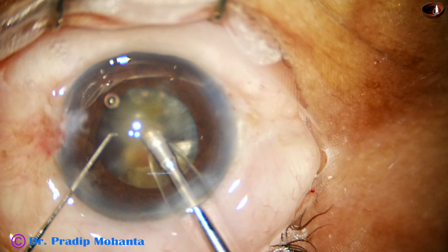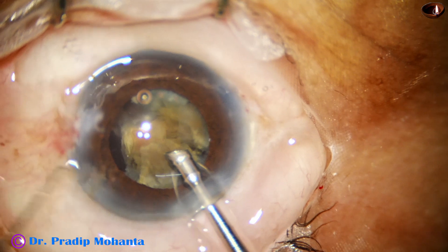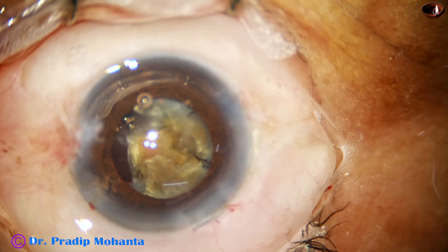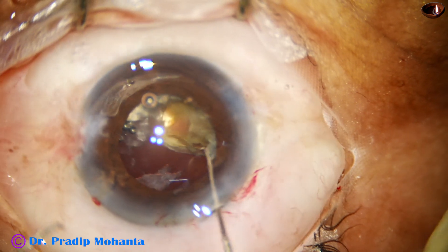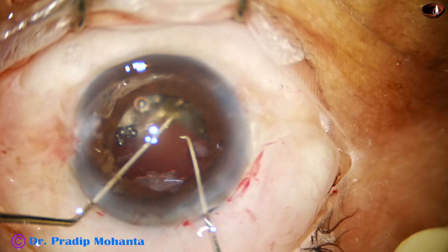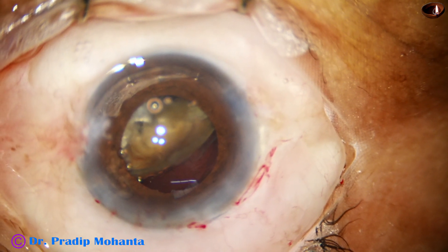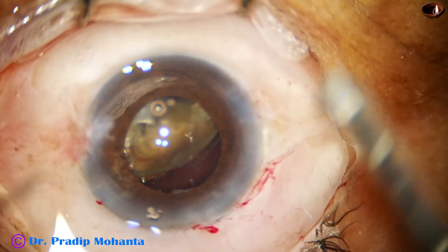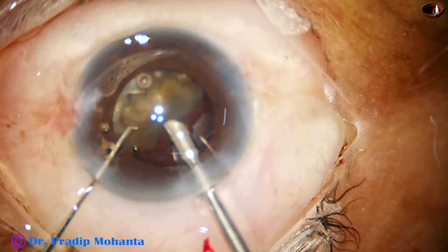If we do surgery with caution, taking care of the surroundings slowly and taking care of all the movements, the results are good and we can complete a tough case. We are dividing the tough case into small, easy parts — that's why we have to spend time. Each part gets quality time, and when we give quality time in this way, we come out safe and do a safe surgery.